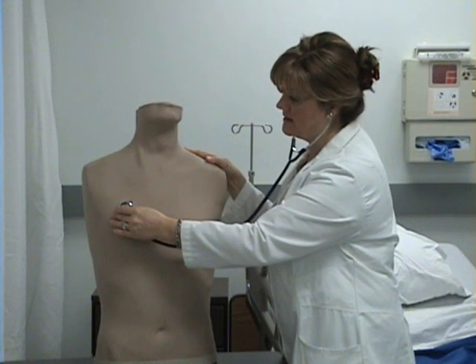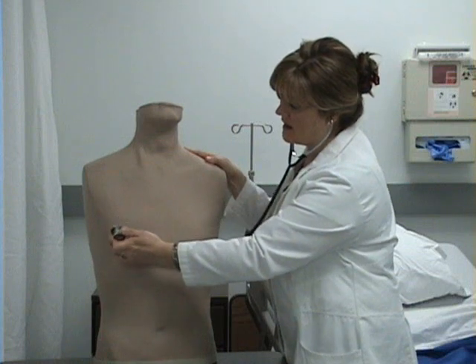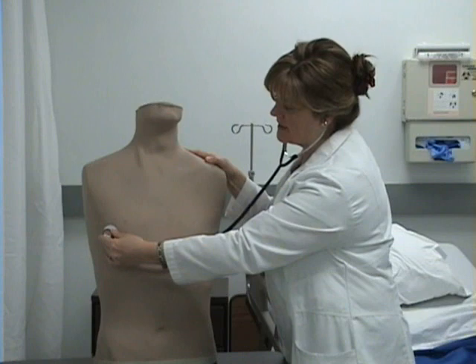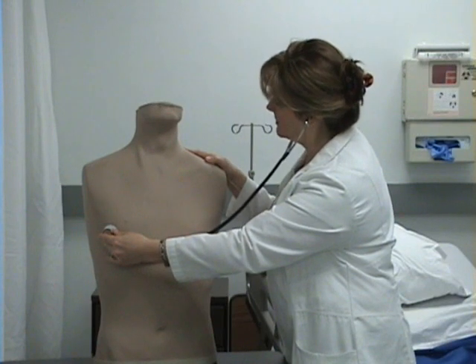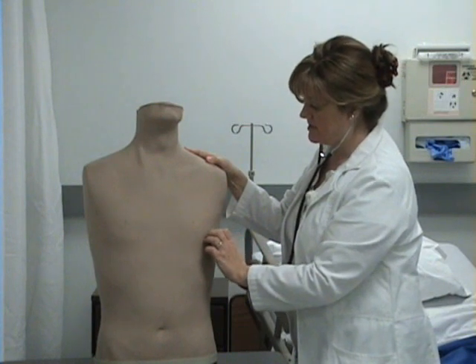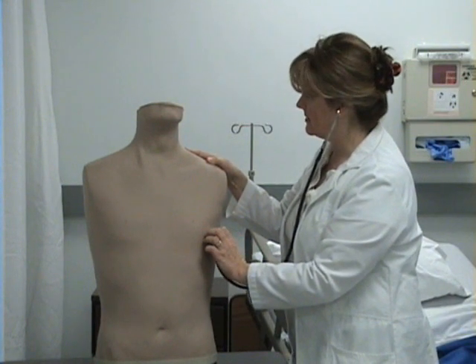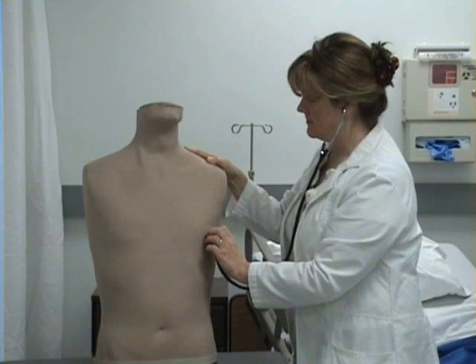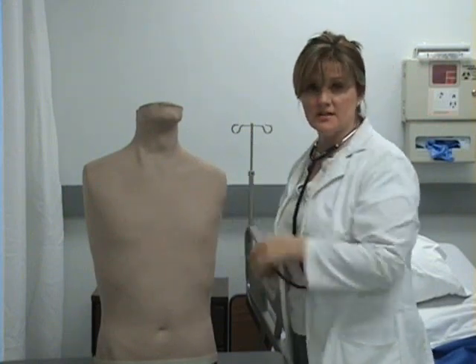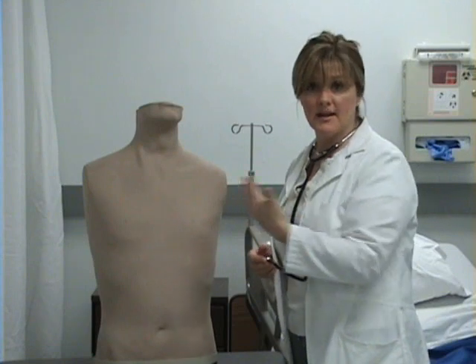Deep breath. Excellent. I'll move down and a little bit lateral. I'm not over bone. Can you take a deep breath in and out? And I need to listen on the left side, safe spot. Deep breath. Excellent. I've noted that the anterior lung sounds are clear bilaterally.